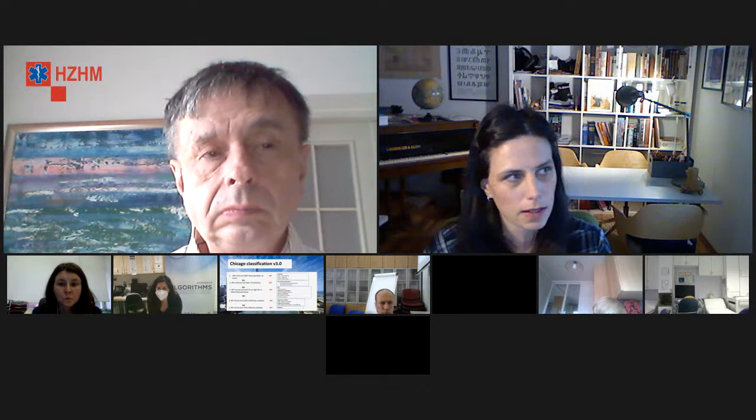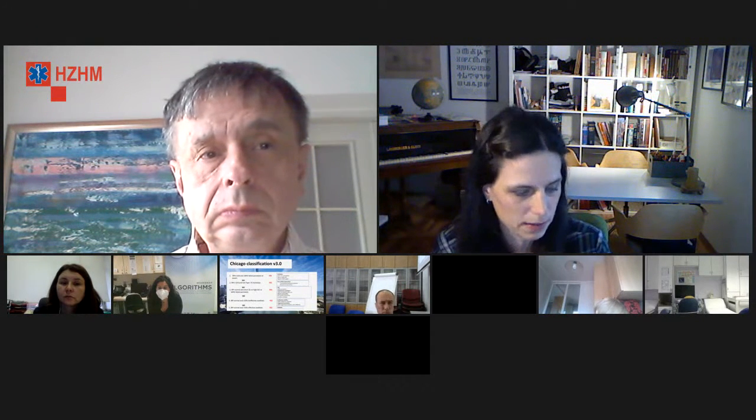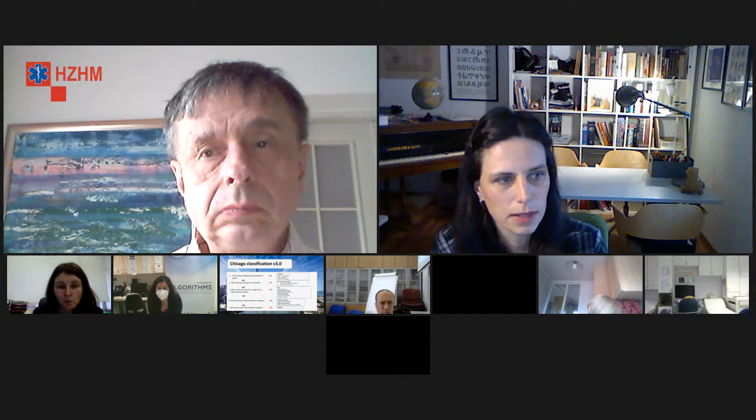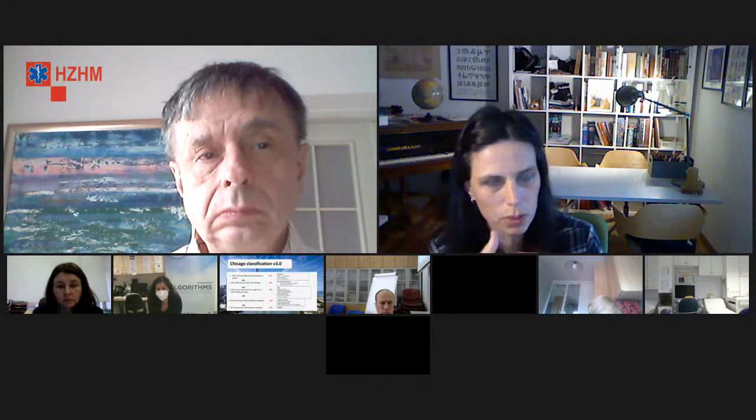Ono s čim se mi znamo nekad zapravo mučiti u analizi je test slobodnog pijenja ili multiple drinking test. Znači, nekad ga izvodite kod svojih pacijenata da vidite kolika je peristaltička rezerva. Imate li iskustvo kako to analizirati? Često vidimo onaj postkontrakcijski gutljaj koji je uredan, međutim nema adekvatne inhibicije ovih gutljaja prije.